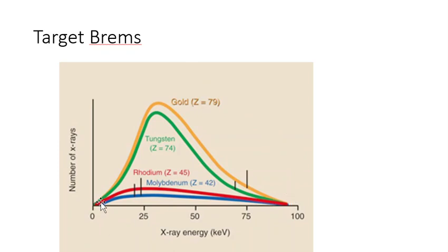Minimum energy is controlled by the amount of filtration, but everything else, including the characteristic spectrum, is going to be different for different types of target material. The reason I don't stress it, and the reason I don't go into things like technique compensation, differences in output, and specifics like that, is because it's not something that has appeared on the registry as of yet.